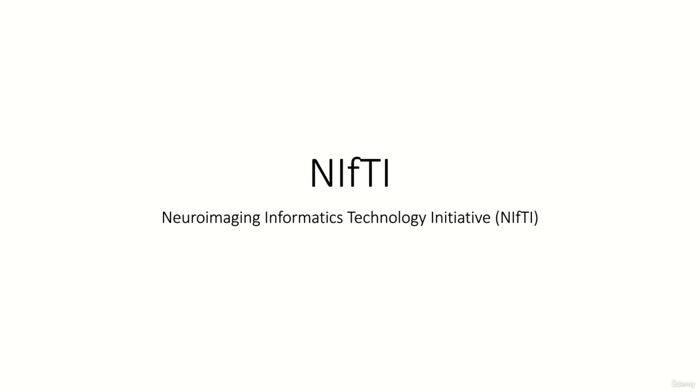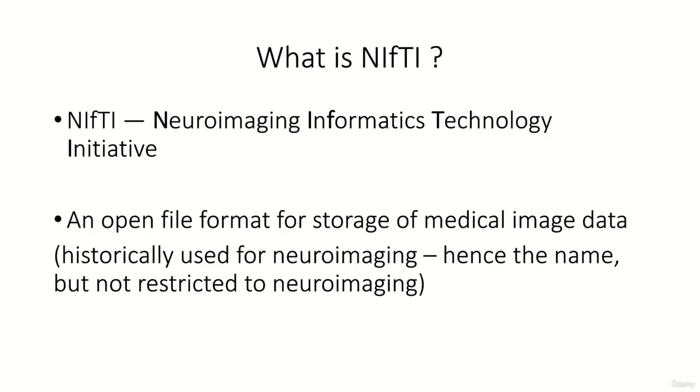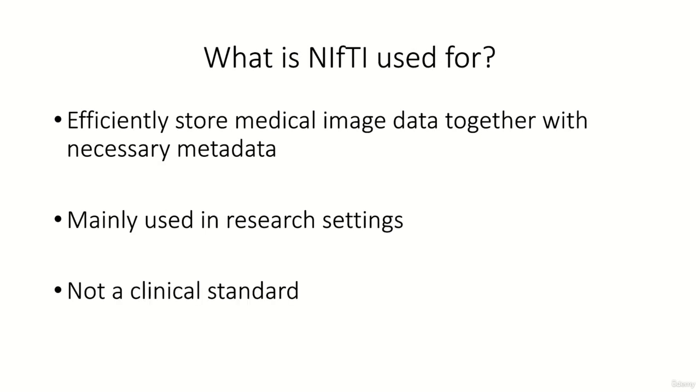In this lecture we will talk about another file format called NIfTI. NIfTI, which stands for Neuroimaging Informatics Technology Initiative, is an open file format to share and handle medical image data. It has its origins in neuroimaging, as the name says, but is now widely used in all fields of medical imaging as well. NIfTI files can be used to efficiently store medical images or volumes together with other necessary metadata.